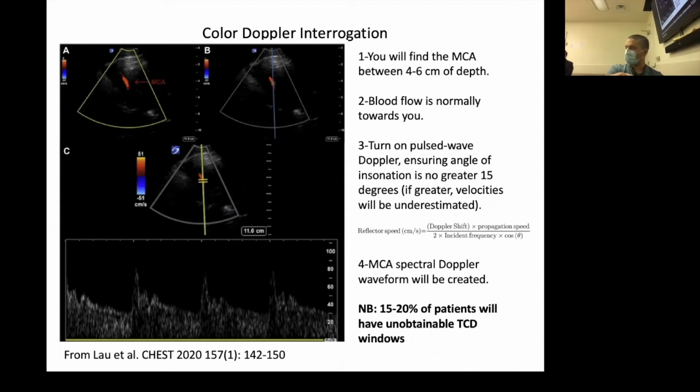And that becomes a real problem when you're trying to interrogate cerebral circulatory arrest, for example, where you say, oh, I don't see any flow, I don't see any vessels. But if you have not demonstrated previously that there was flow in those vessels, you really can't say anything with respect to circulatory events.